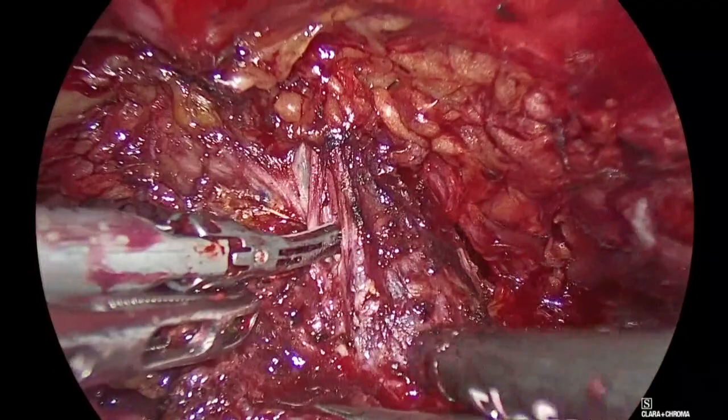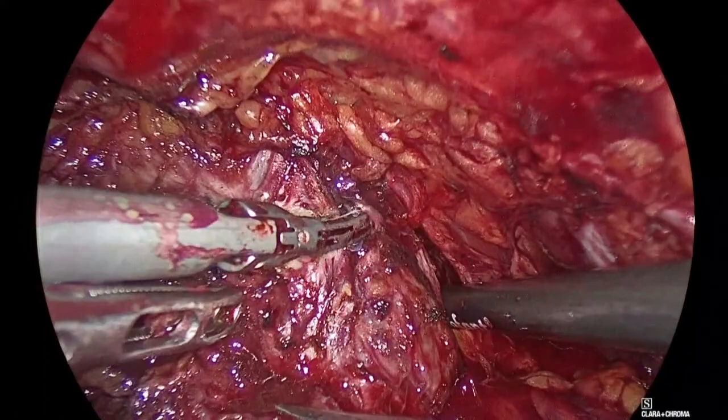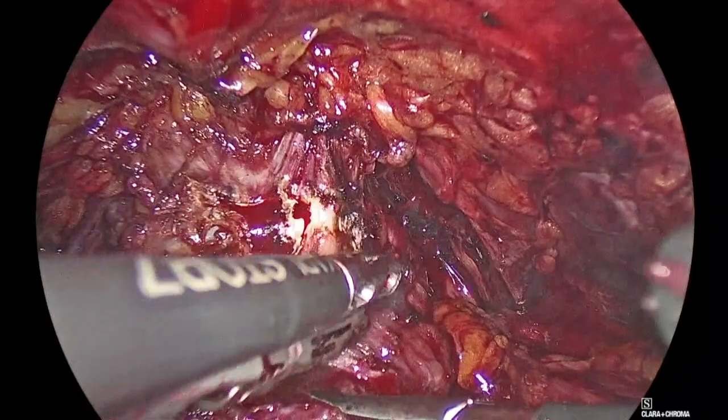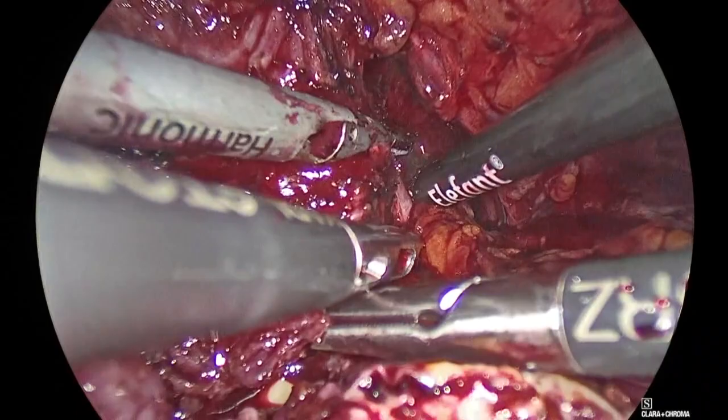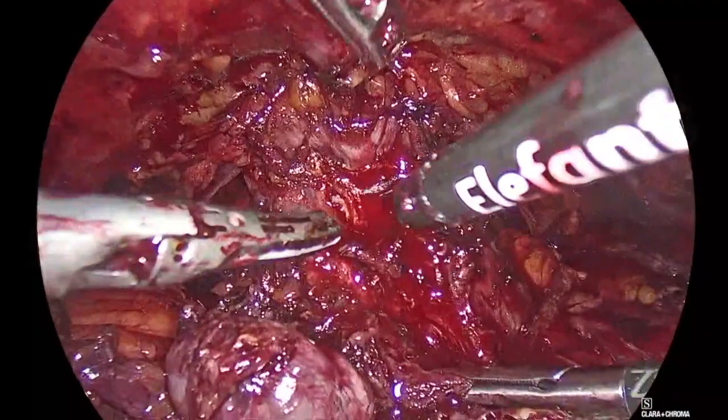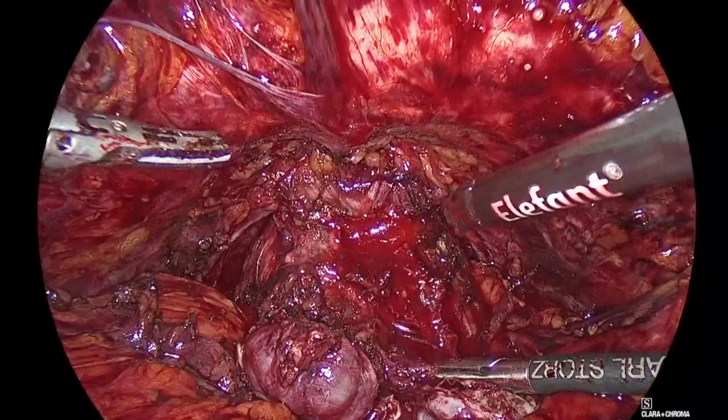Good. Very superficial. Go up to 20 millimeter or? Sorry? Which pressure do you go up? I put it 18 now. That's for what we're doing now, just until we put the Santorini stitch in. Okay, go back. Put it down. Press it down, Panayuti. Down. Give me bipolar, please. Do not aspirate. If it's minor bleeding like this, you can just go and buzz it.